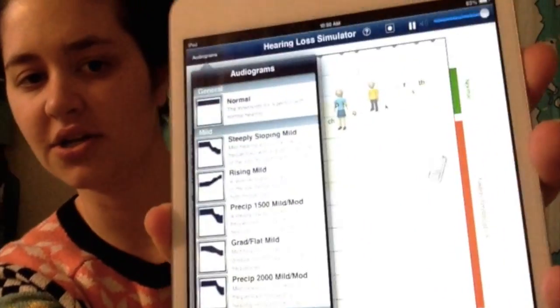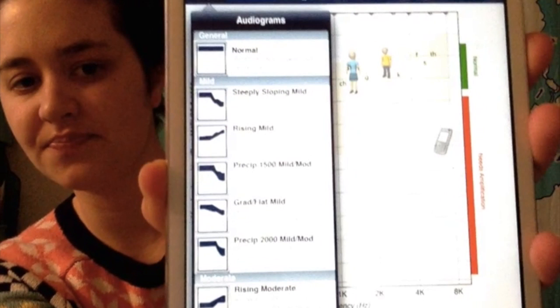You can also access all different types of audiograms. By choosing audiograms that closely resemble the audiograms that you're interpreting, you can get an idea of what a particular hearing loss might sound like and what certain sounds would sound like with that hearing loss.